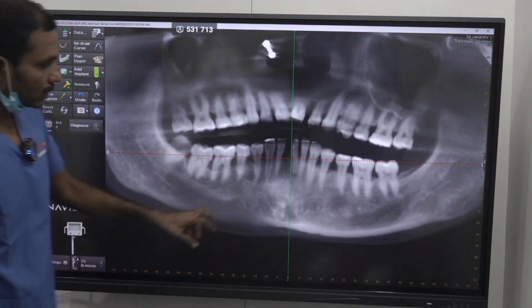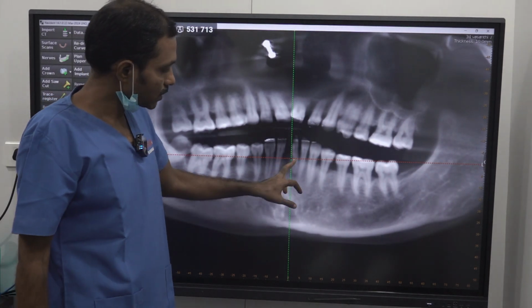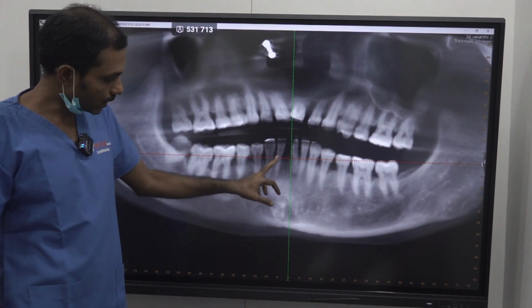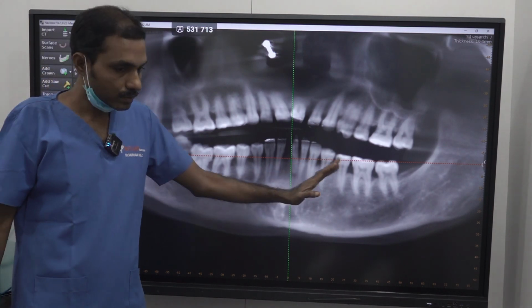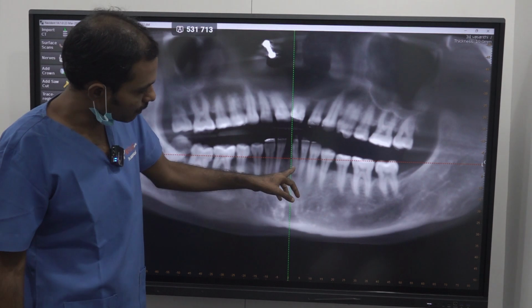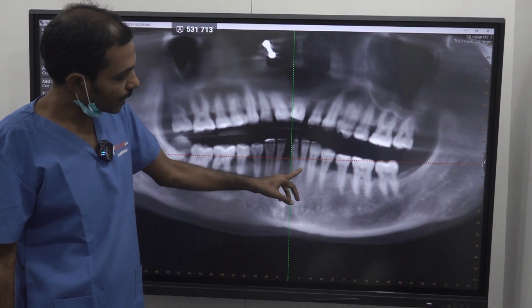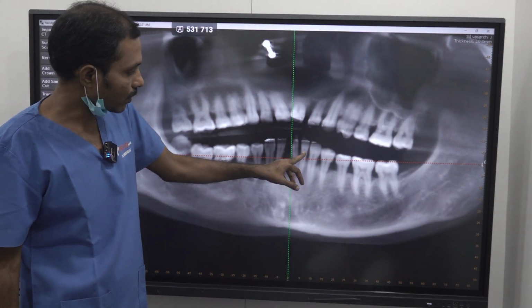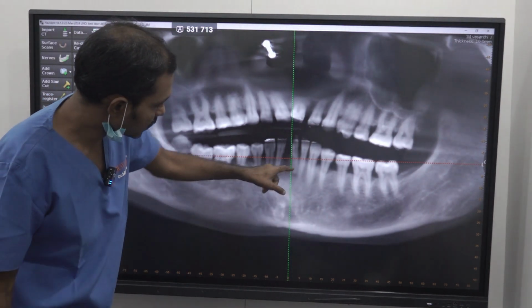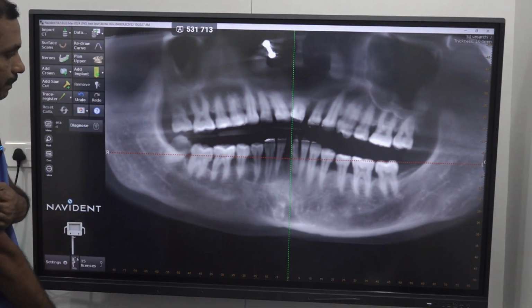2 laterals. 2 lateral extraction. Just you have to place an axial implant. Follow the root just straight away. You don't have to tilt mesially, just a straight implant. Maybe here this may become close to the. Oh, sorry, this lateral also we are going to remove, right? Okay, this lateral we are going to remove. This one, this one. There is some lesion in this 3-2 already.